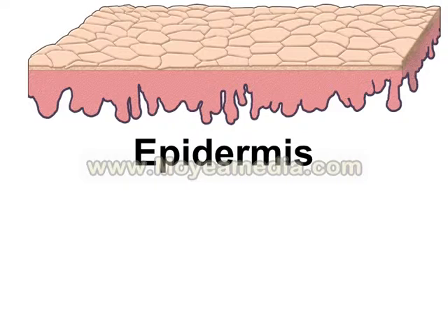This is a carve out of the epidermis. The pattern is quite regular in normal skin, but in pathologic processes often forms irregular acanthosis as pictured above.